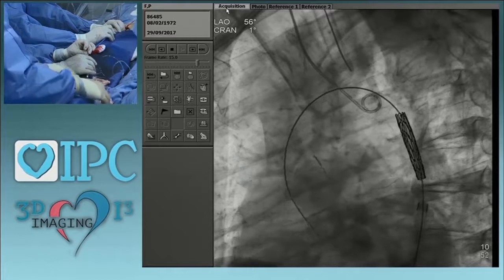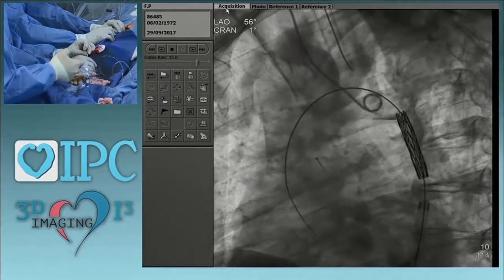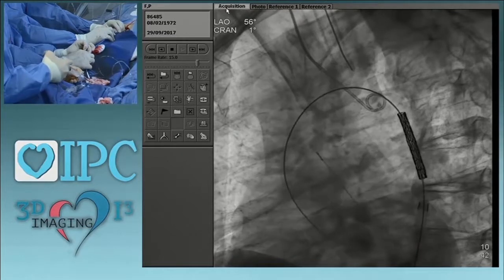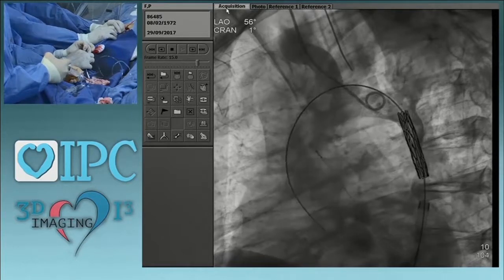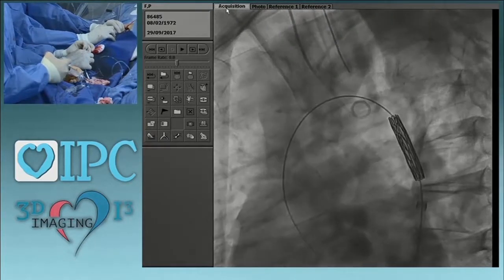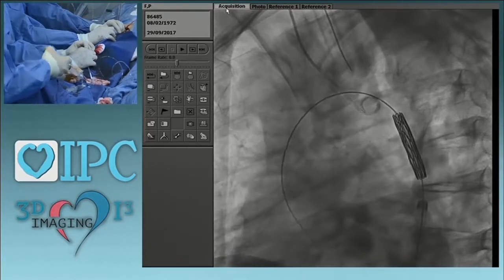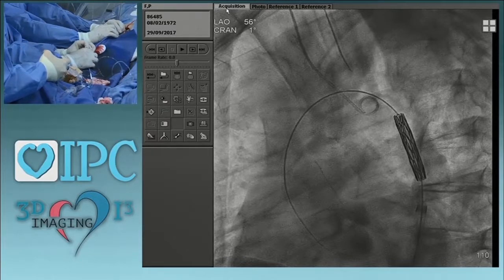Okay. Let's take a look at the angio, please. Yeah, it looks okay to me. It looks so good. We do proceed with the outer balloon. Just a couple of millimeters, 1 millimeter lower. But it is uncovered anyway. Yeah, I know. It'll shorten a little, won't it? Twelve millimeters, I don't think it will shorten much. Okay, 4 or 5. Yeah.